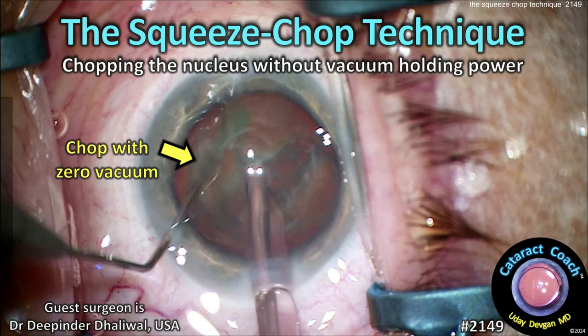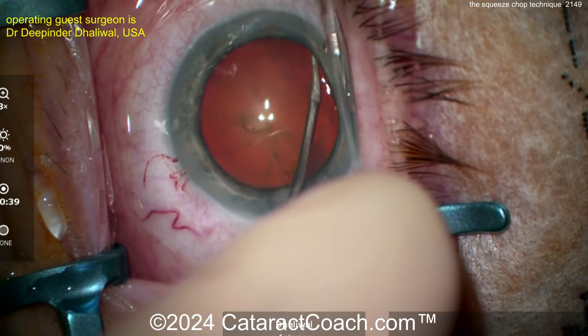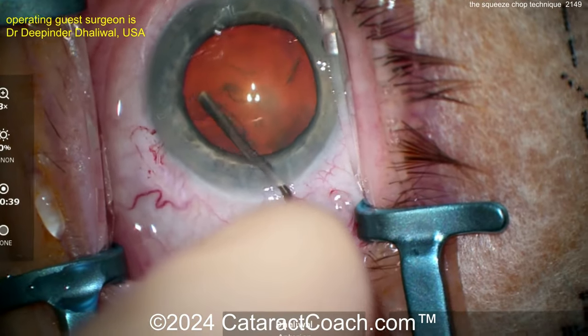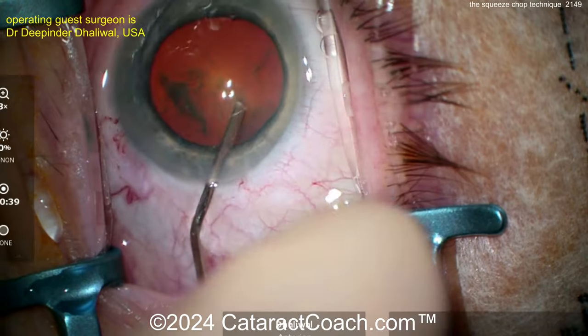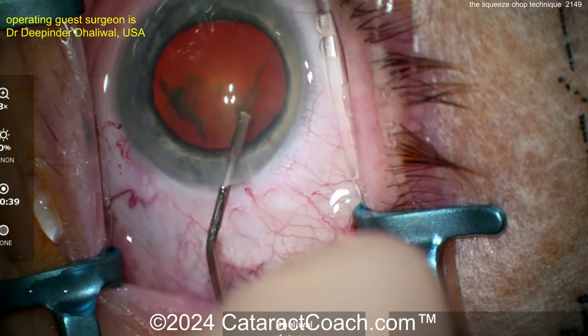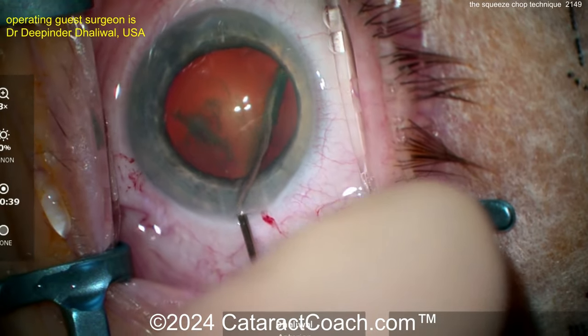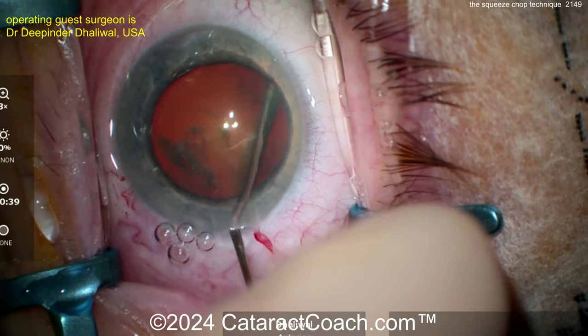CataractCoach.com — the squeeze chop technique: chopping the nucleus without vacuum holding power. This technique is from Dr. Dipinder Dhaliwal, who was our podcast guest here on CataractCoach.com. In that podcast she talked about her routine phaco technique, which is this: the squeeze chop technique.